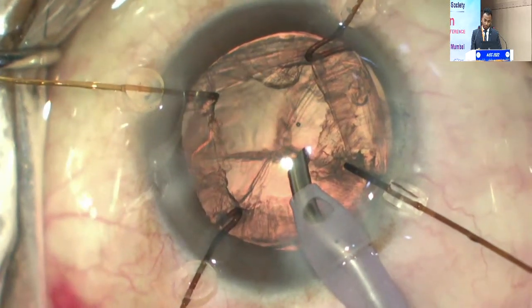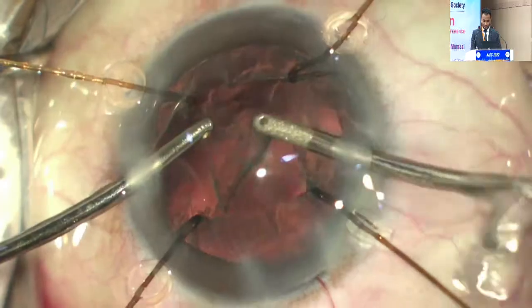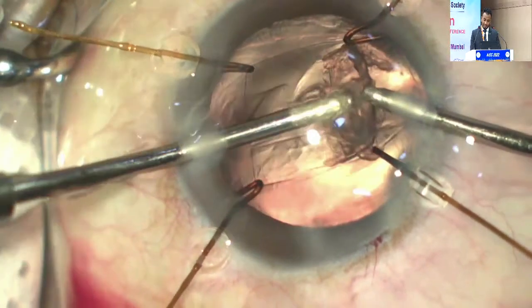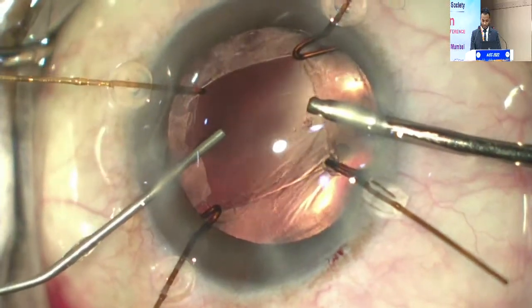Take your time, put your cohesive viscoelastics. There's no PC rent, it just had caught and I have let it back in time. The cortical cleanup was done. So in this case, I preferred to put a CTR after doing this because the bag was fairly stabilized.